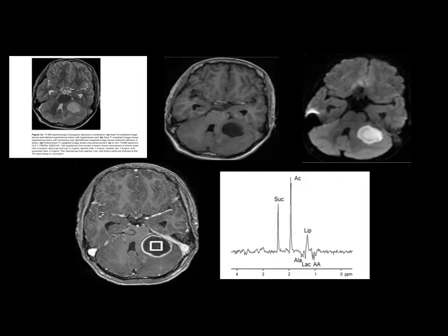There is no NAA here, it is lost. It's an abscess. NAA should be here, it is lost. And choline should be here, and creatine beside it. But there is no neurogenic tissue at all, so it will be absent.